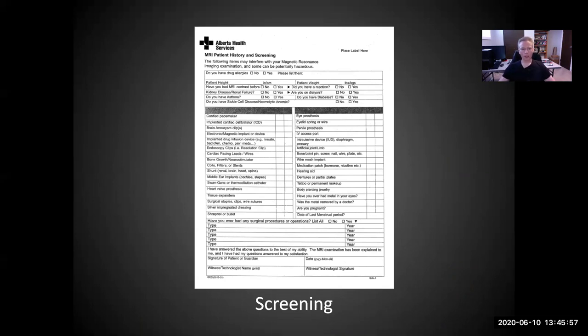The top section that is listed under patient history is intended mainly for clinical subjects. However, there's a few things that you should know when it comes to research participants who do not typically have medical issues such as they're listing here.